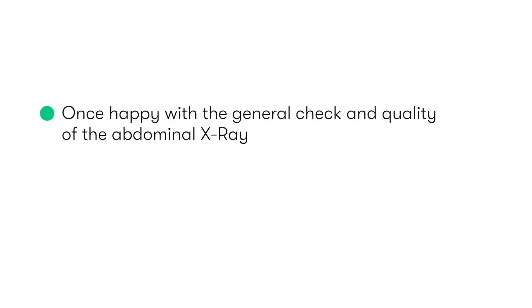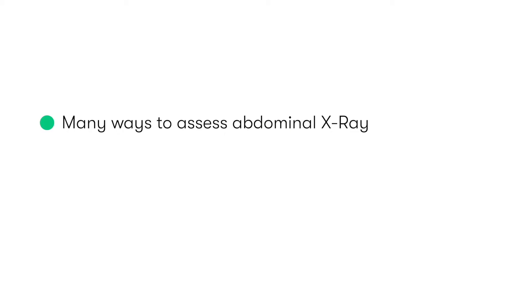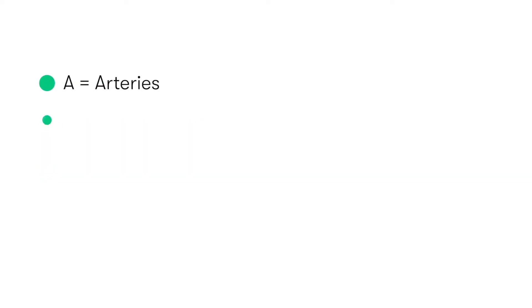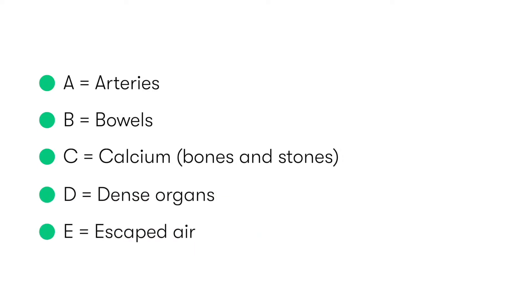Once we're happy with the general check and quality of the abdominal X-ray, we can begin our systematic approach for identifying abnormalities. There are lots of different ways to approach an abdominal X-ray, but the surgical teaching approach uses the mnemonic ABCDE: A stands for arteries, B is bowels, C is calcium (so bones and stones), D is dense organs, and E is escaped air.